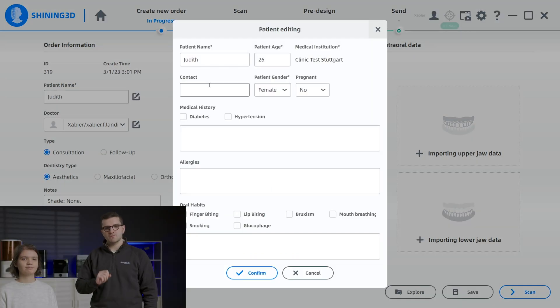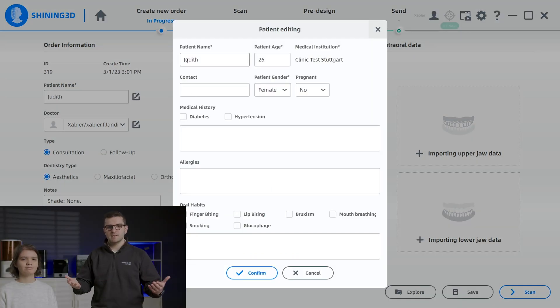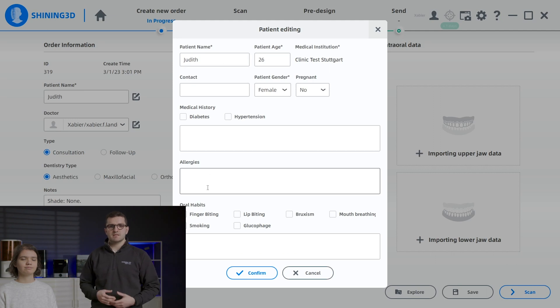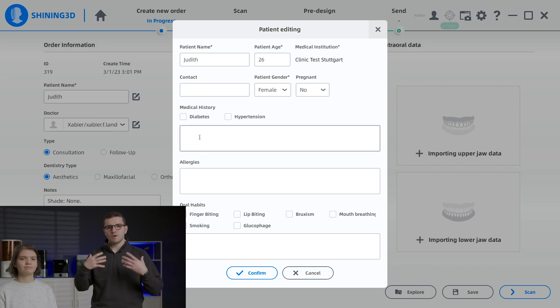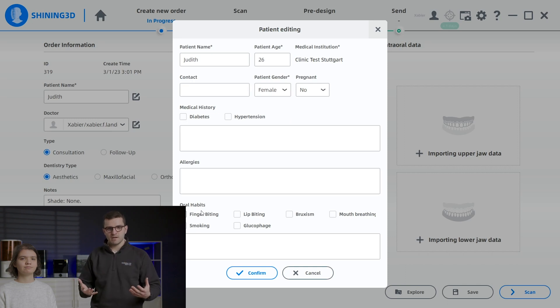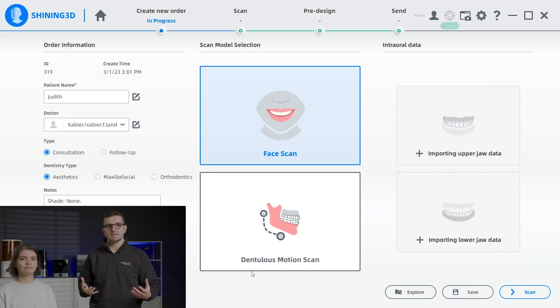But that's not all. We can also add more detailed information such as medical history, allergies, and oral habits to provide a more comprehensive record of the patient's dental health.